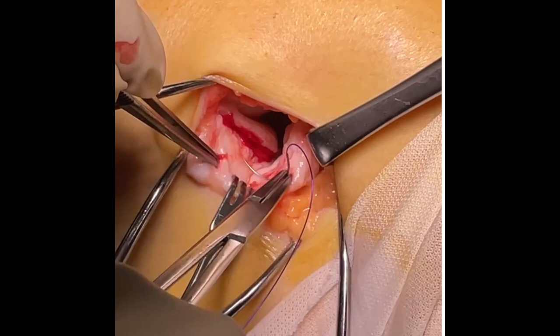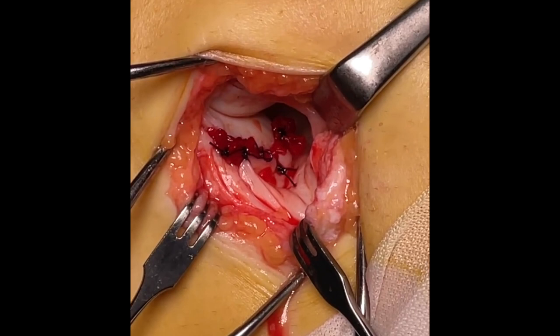Absorbable 2-0 PDS sutures are used to capture the superior and inferior leaflets of the meniscus and secure the clot in position. This step is repeated as needed to complete the repair. The capsulotomy and retinacular layers are repaired and the wound closed in layers.